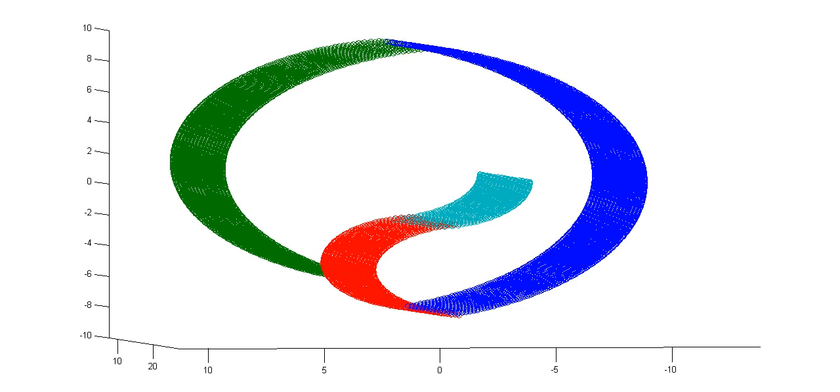And so fMRI can measure levels of oxygenated blood, or changes in levels of oxygenation in the blood. It turns out you would see this in a normal MRI, but normal MRI is done somewhat slowly. The person has to sit still, and you collect data for like a minute or something and average it, or many seconds.